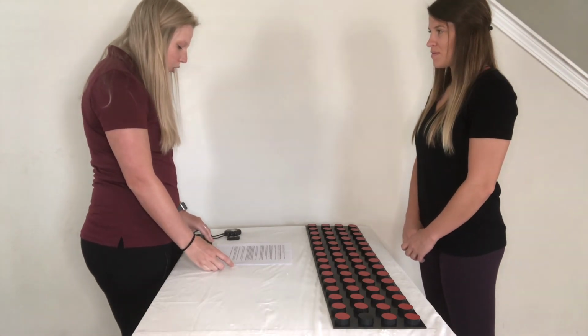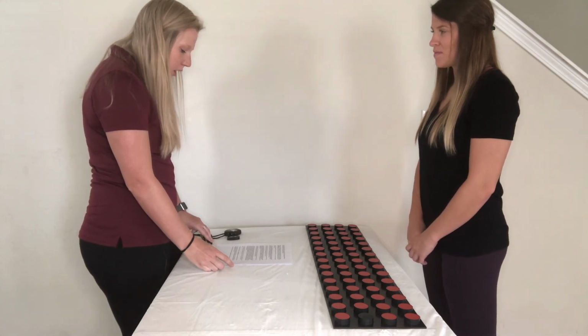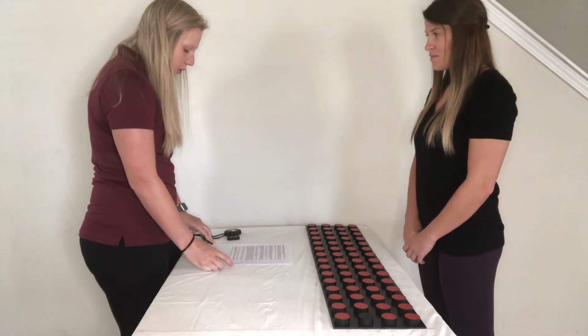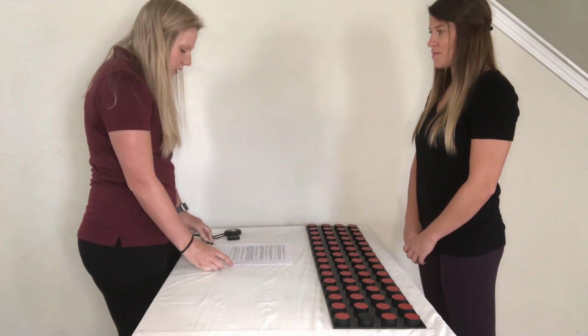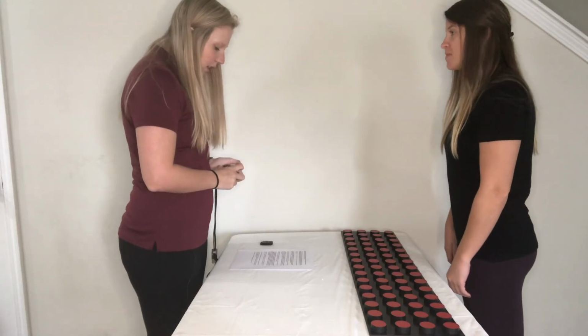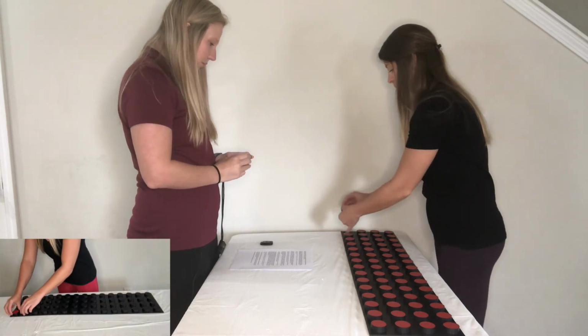When you finish one trial, the board and discs should already be in the starting position for another trial. In other words, the opposite color on the disc is now exposed. Please do not touch the discs until you hear further instructions. Put your left hand on the disc in the top right-hand corner of the board. Ready? Yep. Go.